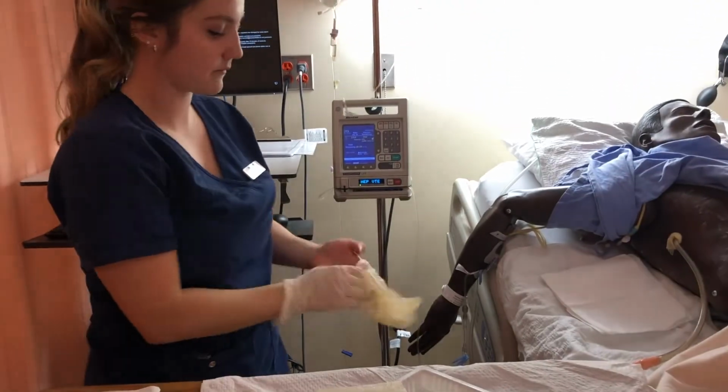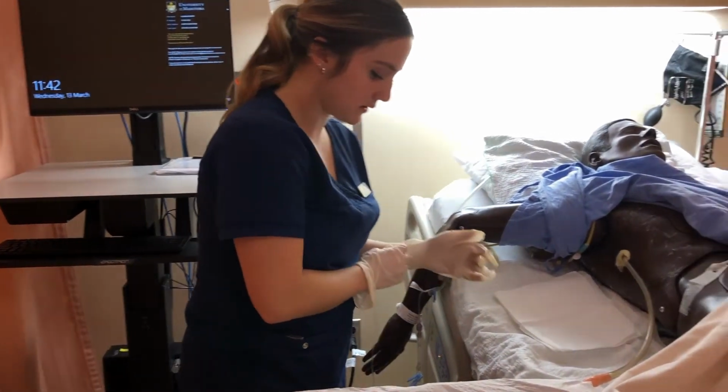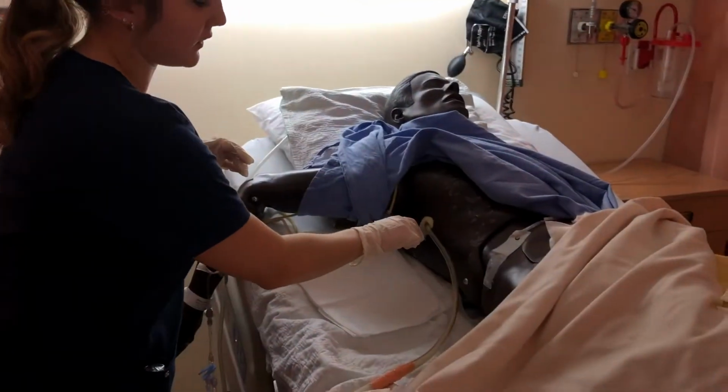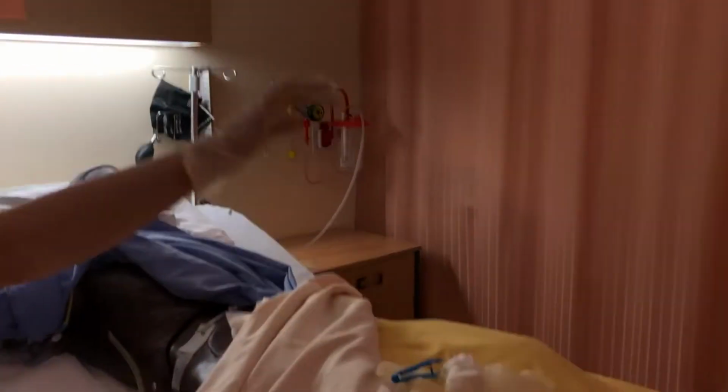Okay. So, I'm going to just kind of assess the site to see if there's any redness or excessive drainage. I'm going to use my blue forceps to take off the old adaptic dressing. And those are garbage too.